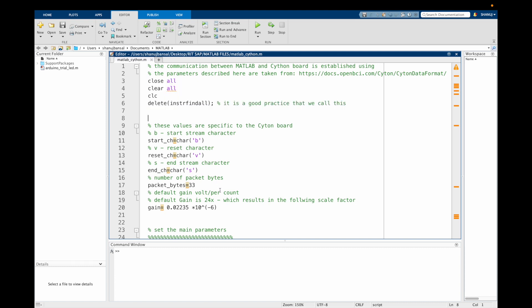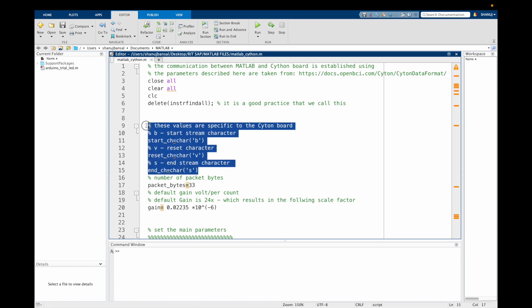Now we define some values which are specific to the Syton board. The Syton board sends no data until it is told to start sending data. To begin the data transfer, we have to transmit a single ASCII character B. Once the character B is received, continuous data transfer in binary format will start. To stop, we have to send an S.